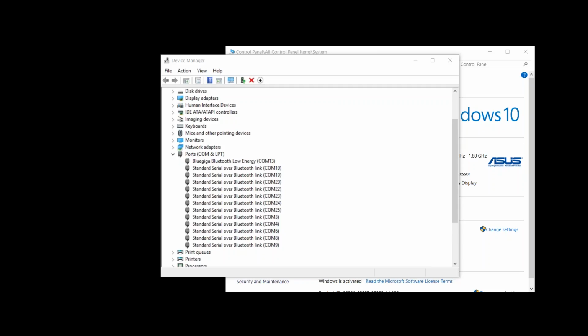Yes, we're having the same 14 days free trial policy as with the previous version of Muscle Monitor. So that hasn't changed. All you need to do is simply ask for the trial code. Of course, Muscle Monitor will require the Bluetooth dongle, and that can create a problem, but we can discuss it in separate cases. So it's possible.